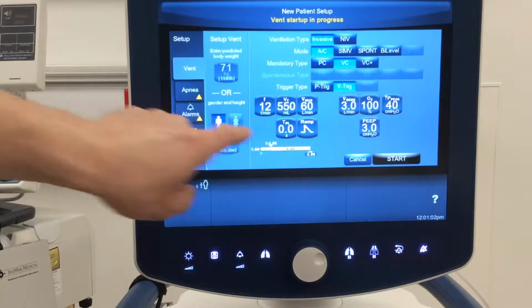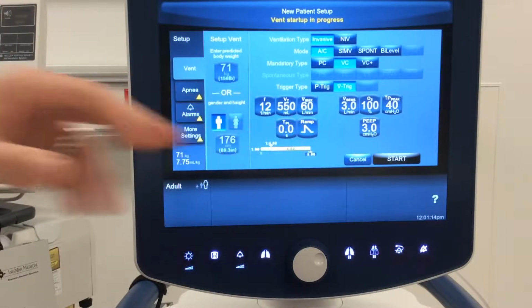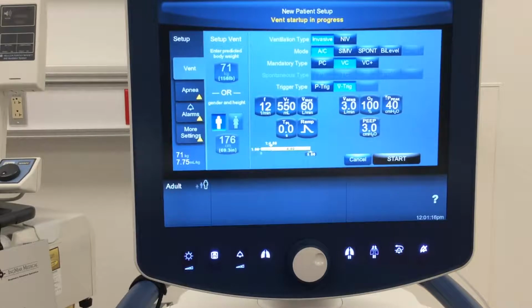So, TPL. TPL is time for plateau, or a pause time. We don't routinely set a pause time. What that means is you give your 550 mils and then hold it in there for a certain amount of seconds every breath. You can use that as a way of being able to measure something. You could use it as a way technically to improve somebody's oxygenation. However, it's quite uncomfortable, and it's not typically something we routinely do. Although if you wanted to, you'd have the ability to do so.